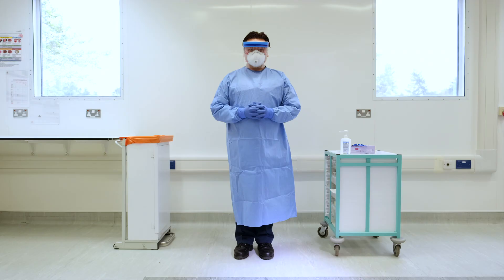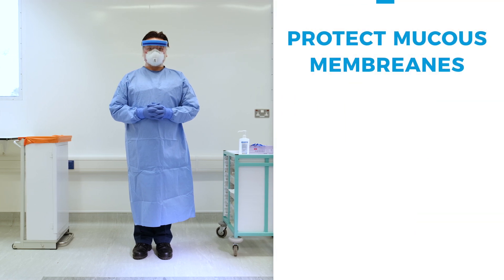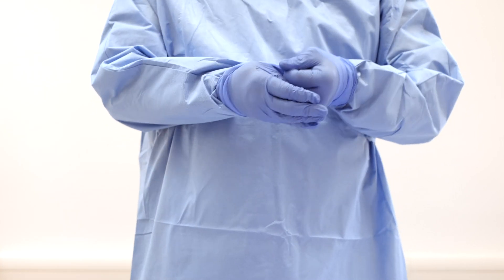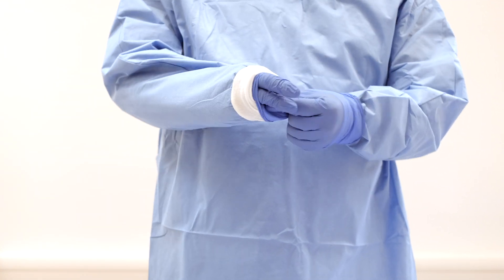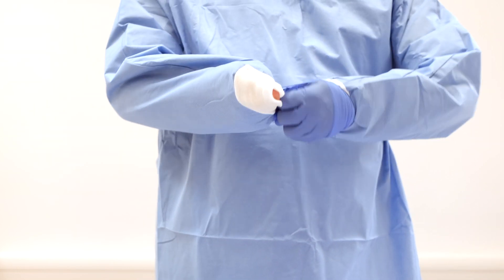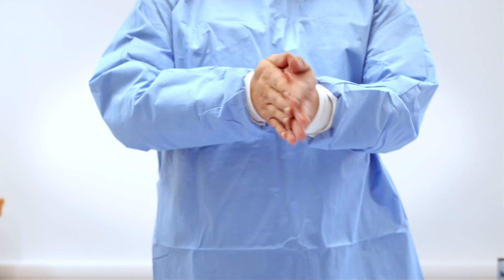When you have finished the care activity, personal protective equipment must be promptly removed. It is imperative that you protect the mucous membranes of your eyes, nose, and mouth. The first stage of PPE removal is inside the single room. Remove the gloves first, as these are the most contaminated part of your PPE. Do not touch the outside of the gloves as this is contaminated. Dispose of them in the bin and then perform hand hygiene.